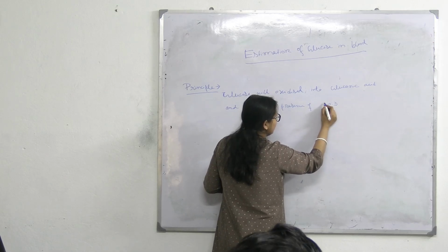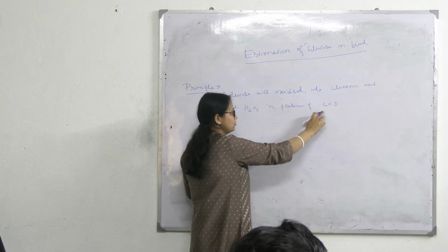I am using this abbreviation form, but you have to write in full form, that is glucose oxidase.